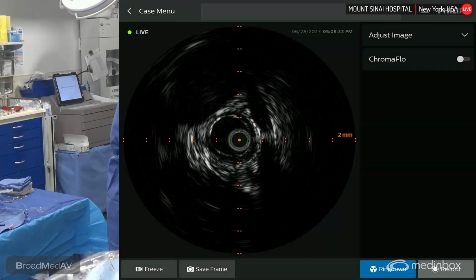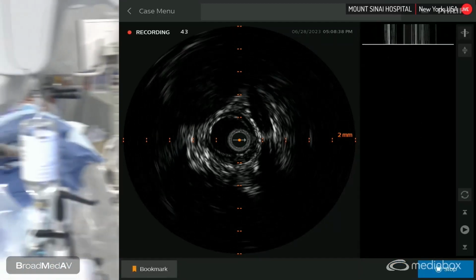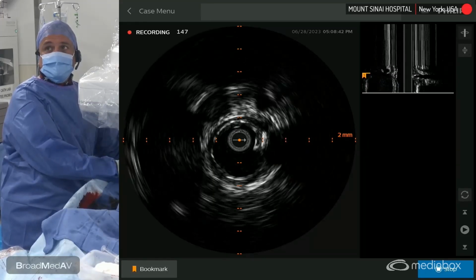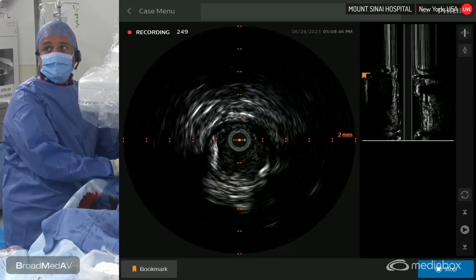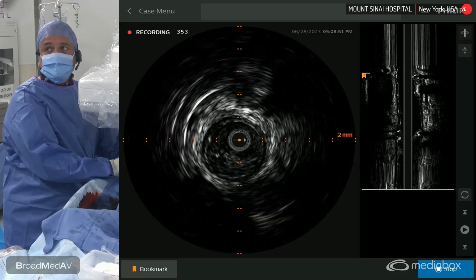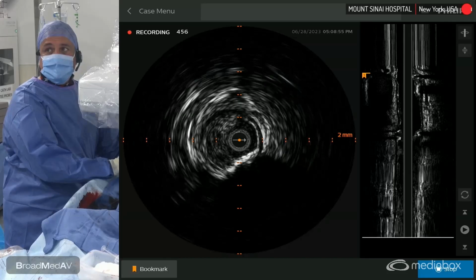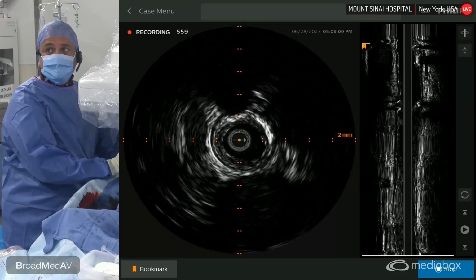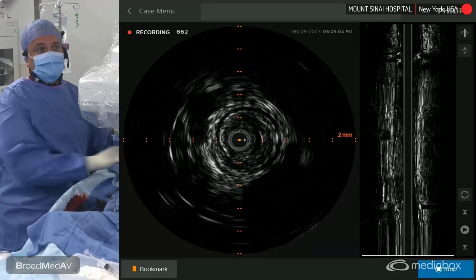So I'm starting with IVUS in the popliteal. So start recording, please. Okay, so as you see the IVUS, it's a good sized lumen. I'm just pulling back slowly. And as I'm pulling back slowly, you can see there's not much thrombus there. And then you can see a lot of soft plaque. And then there's the area of occlusion with what looks like soft plaque and pretty much occluded around the catheter. You've got to think there's underlying thrombus there at some area. And then you can see the different areas of stenosis.